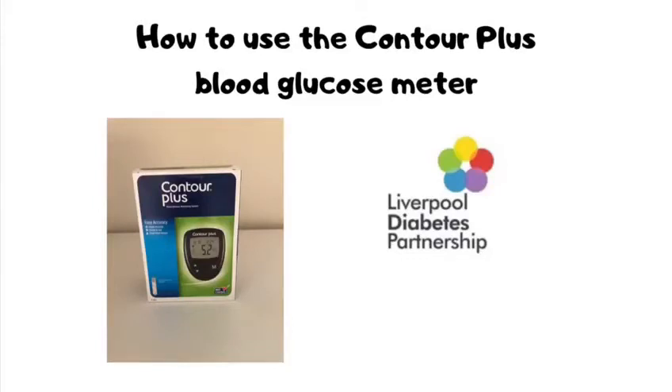This video has been put together by Liverpool Diabetes Partnership and it is a step-by-step guide on how to use the Contour Plus blood glucose meter.